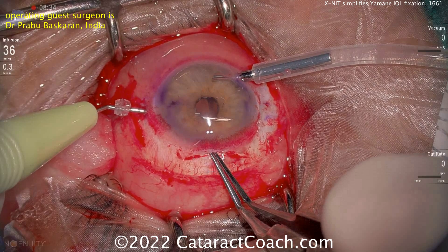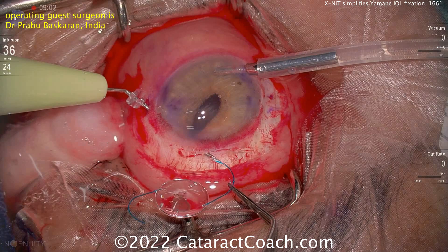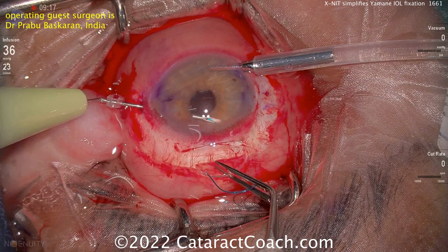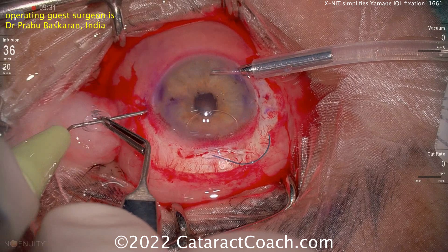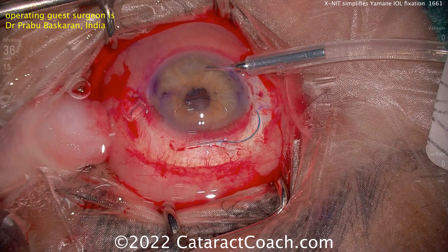Now you can grab this, and you see also why the infusion — the AC maintainer — is so important, so that you don't get collapse. Now that comes outside the eye, and very easily, with the lens in the correct orientation in an anti-S configuration, you can feed one haptic into the bore of the needle, hold the optic, and extract the needle pulling the haptic through. This is brilliant because it's done outside the eye, and the IOL will slip nicely behind the iris in a planar fashion — no acrobatics in the mid-vitreous. Once that needle is pulled through, this collar acts as a stay to hold on to that first haptic so it won't fall into the eye inadvertently.